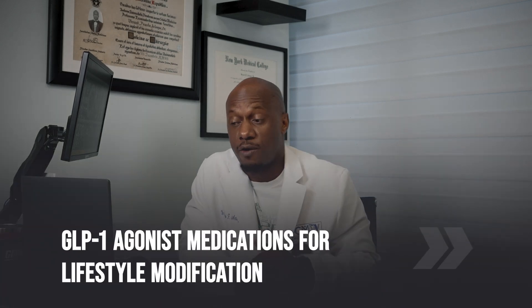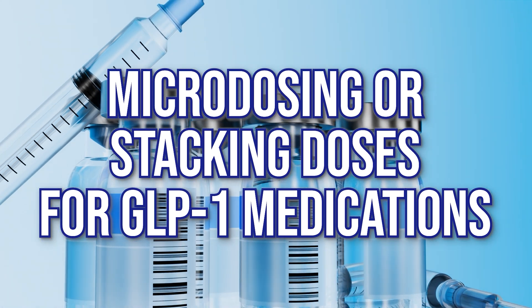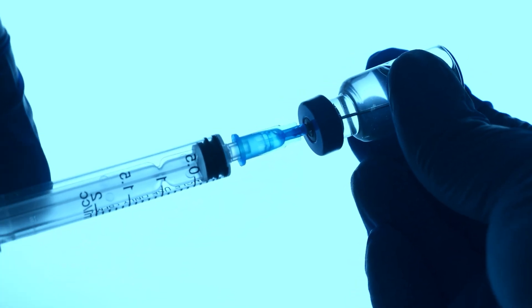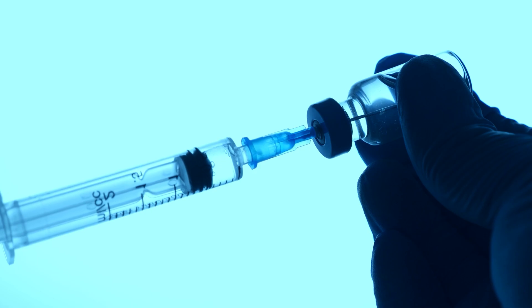I'm Dr. G, an internal medicine physician in Hollywood, Florida. I'm an expert on GLP-1 agonist medications for lifestyle modifications, and I'd like to talk today about micro-dosing or stacking doses for GLP-1 medications — whether it's a problem or a fix — and how to do that when your medication is presented in one of these auto-injector pens, which have become common over the last 15 to 20 years.